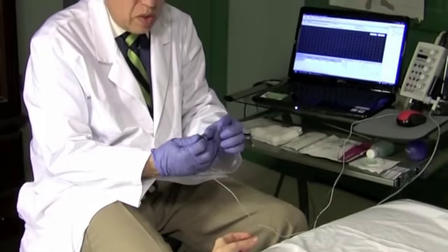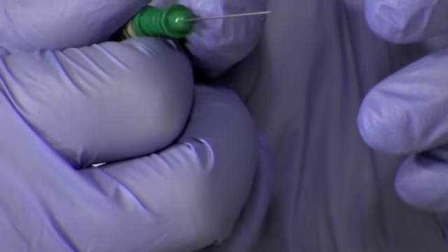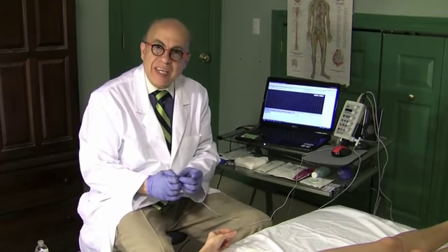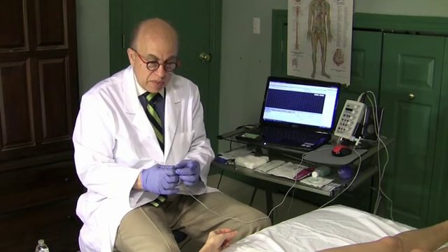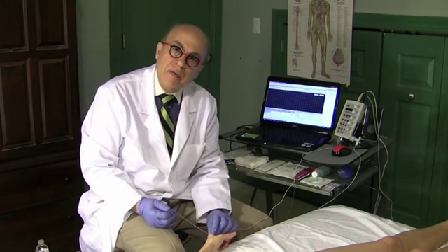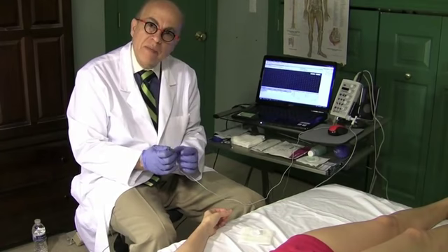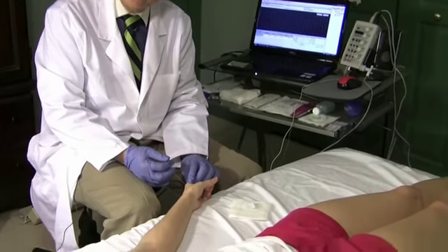By the way, I just want to show you, that's the size of needle that I normally use. It's 37 millimeter, 26 gauge. And I like this because it's not likely to bend inside the muscle. It's not skinny enough so that it bends. I've never had a needle break, by the way, inside the muscle. And it's firm so that you can explore the muscle and not really have the needle be in the way and hurt the patient too much. It's best to have a firm needle to study the muscle, because if you're studying big muscles, you want to make sure that it doesn't bend inside.